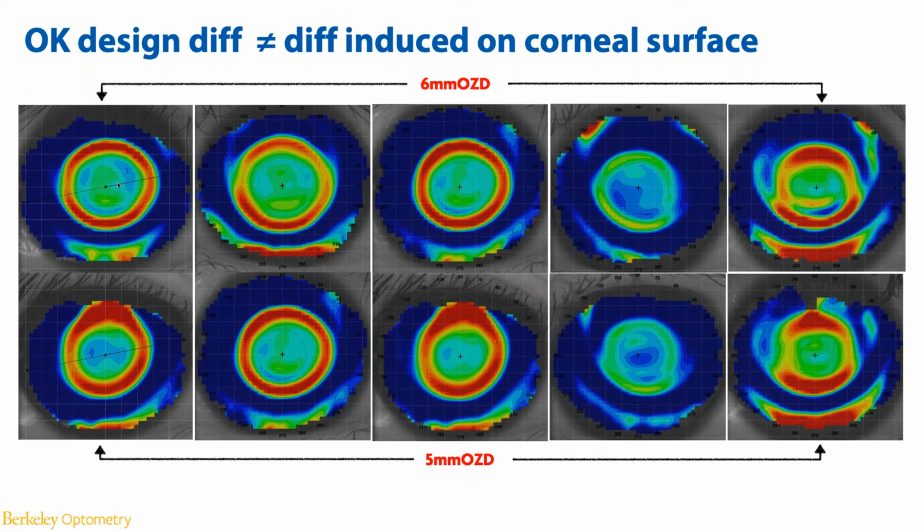Again, as I said, my top two indications: number one is for existing CRT patients, if I see a subtle pseudocentral island, my go-to problem solving would be a smaller OZ. And the second is if I'm seeing an anisometropic patient, I will probably use two different OZs for two eyes. And third, if I'm fitting a smaller cornea, I will definitely use a 5mm OZ.